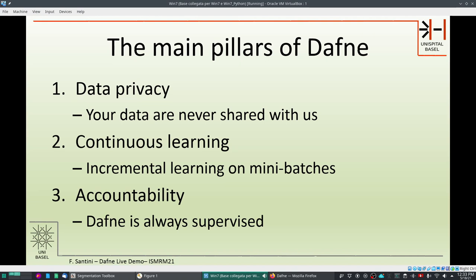The second pillar is continuous learning. We perform incremental learning on just a few slices of every subject so that we don't have to wait for many subjects to be segmented before seeing an improvement in performance. You can trigger a learning step at any time during your workflow, or it is automatically triggered when you export the data.